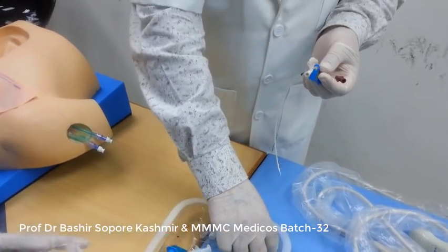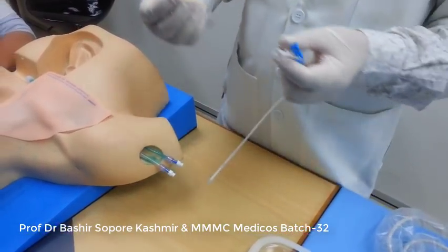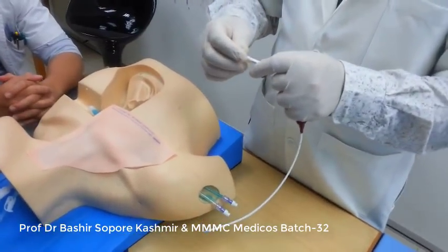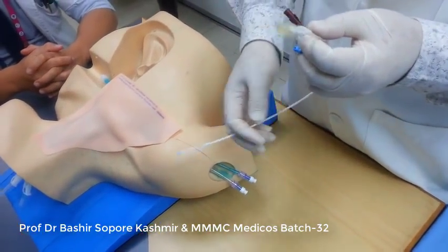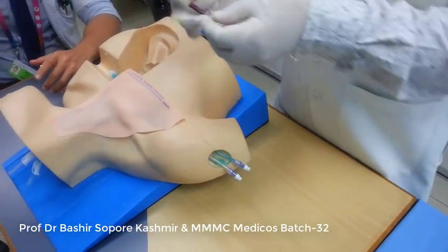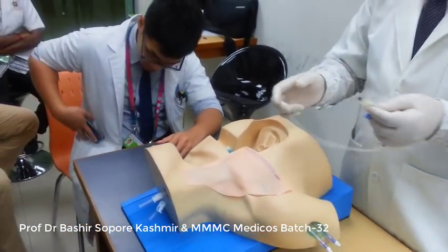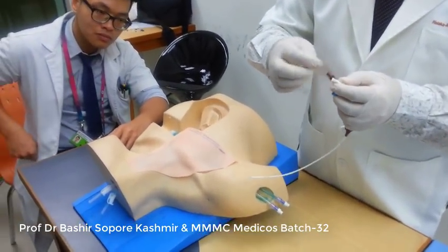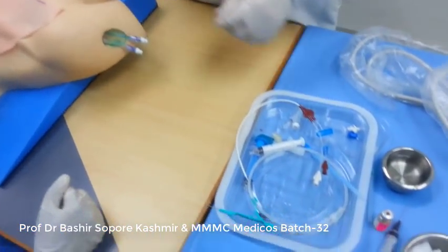So you have to cap it. You understand my point? So cap it like this. See, the other knob is there. So these two ends have to be knobbed. So this was all about the catheterization kit. You got my point?